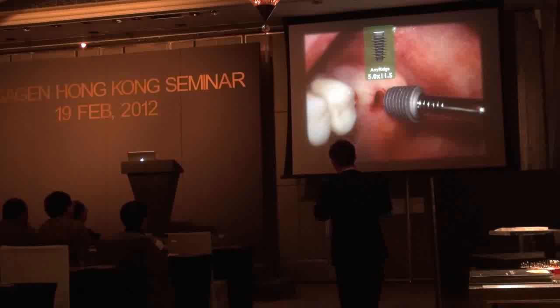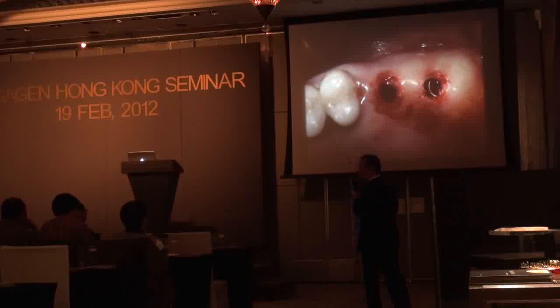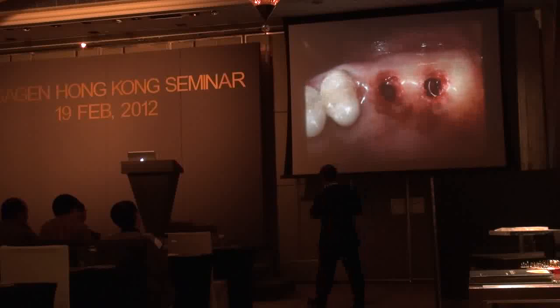Yes, of course, we can place these big implants through this small hole because of the design. You might worry about gingival damage during placement, but the fixture can damage only this small area, and then the other threads just follow the initial thread.